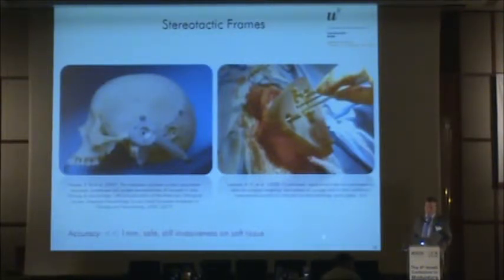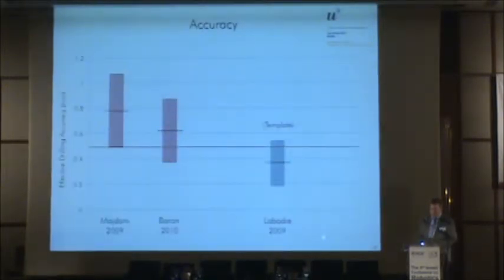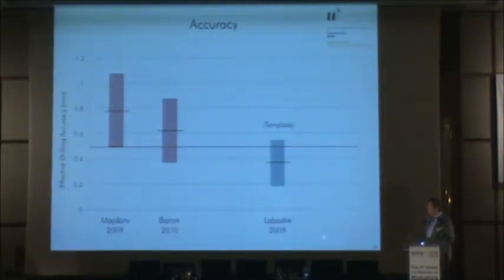So this was for the first time an accurate level of image guidance, I would say, a brute force engineering attempt, but it reached the accuracy. So here we see the accuracy levels. As I said to you earlier, we have the problem of accuracy. The robotic approaches were above the 0.5 millimeter accuracy, and then Rob Labadie and his team actually reached the 0.3 millimeter threshold with their template. So that gave a boost basically to all the teams in the world who tried to come forward with these procedures.